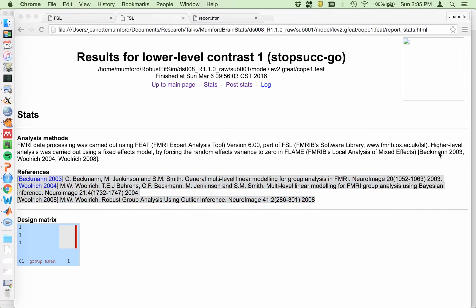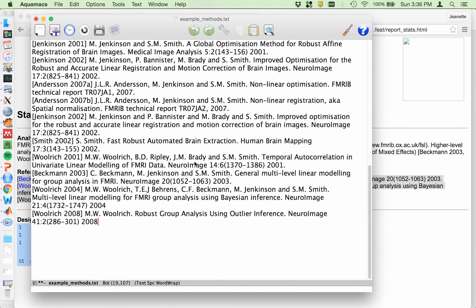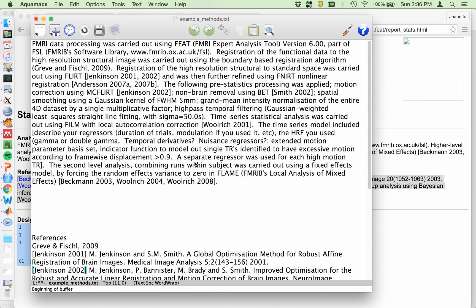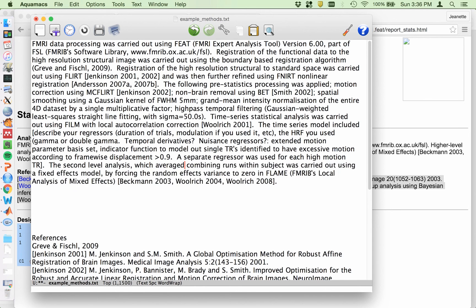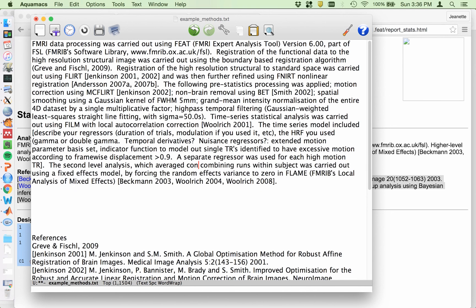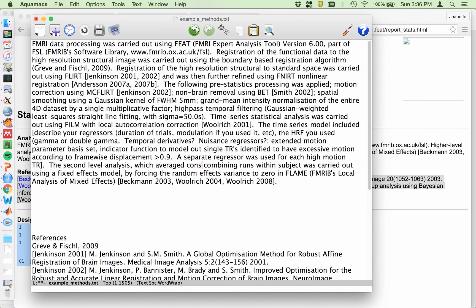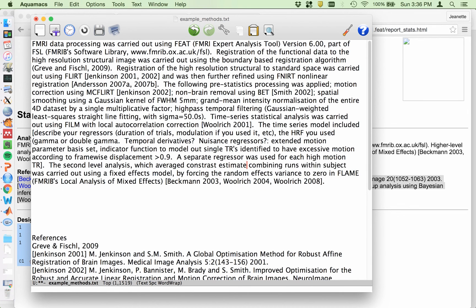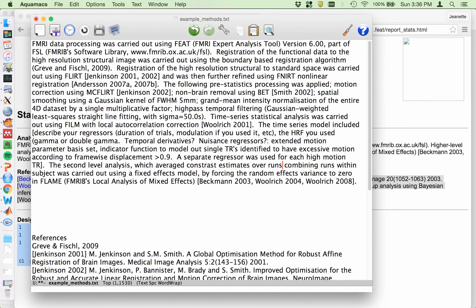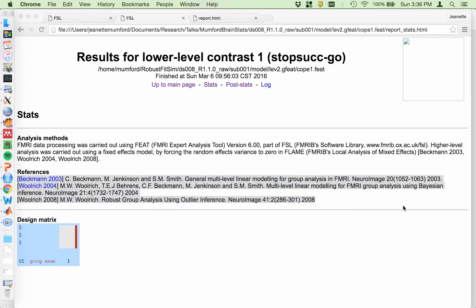And then you would also describe what this model did. So in my case, I could just say here, which averaged contrast estimates over runs within subject. So that's enough. They know it was a column of ones based on that. Done. And let's see, that was the stats. There's no post stats again. I didn't do any thresholding. On to the group level.